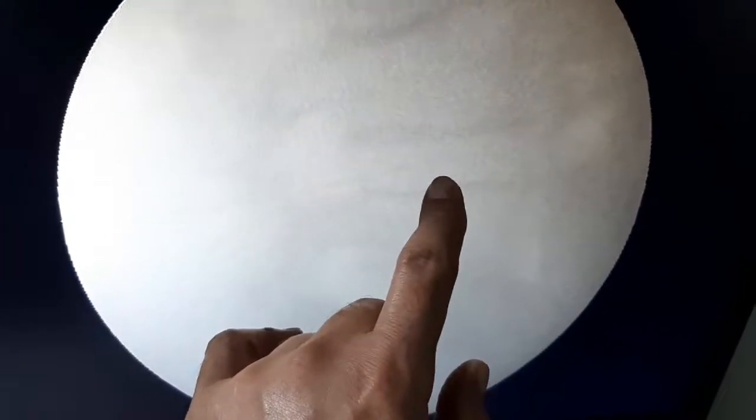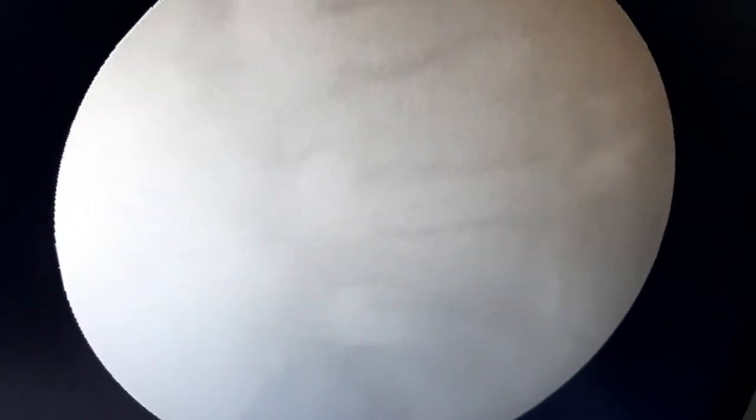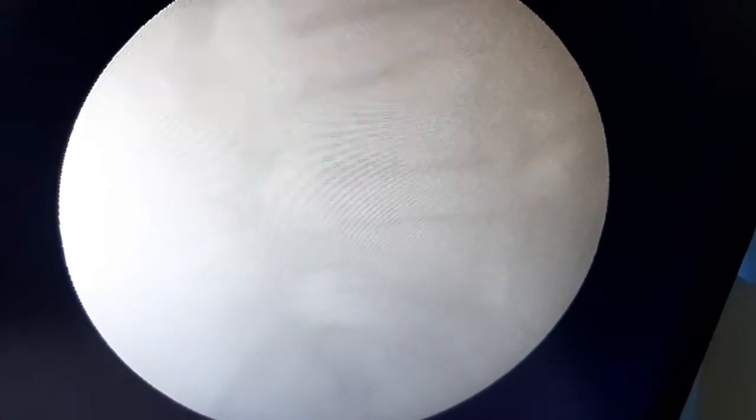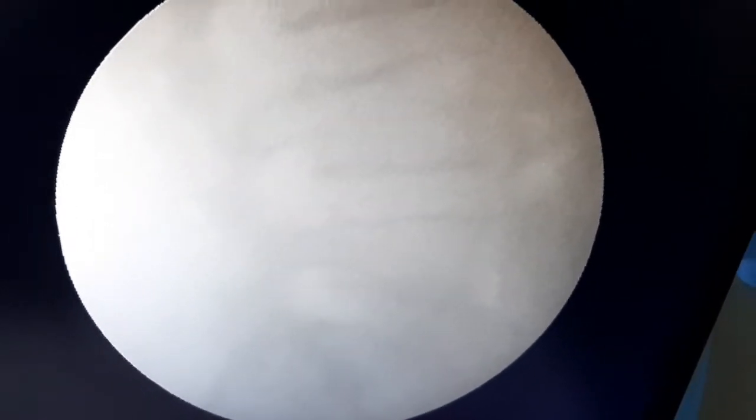This is the lateral view. It is not very clear, but if you can see, this needle is in the center of the disc. With the intra-discal needle in place, I had options: I could add ozone, I could add PRP, or I could add steroids. The patient wanted PRP, but I added steroids.